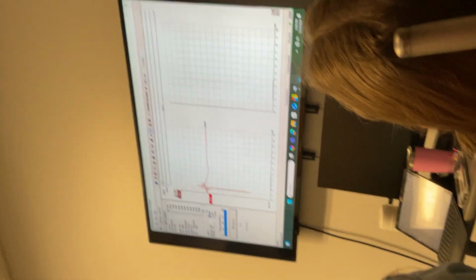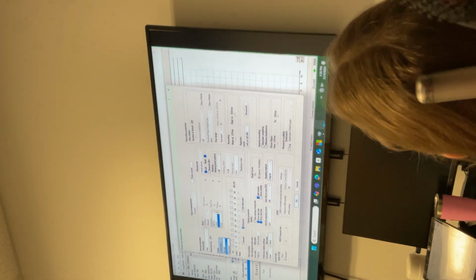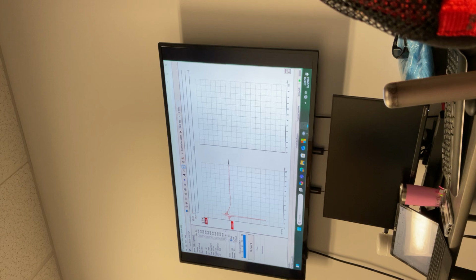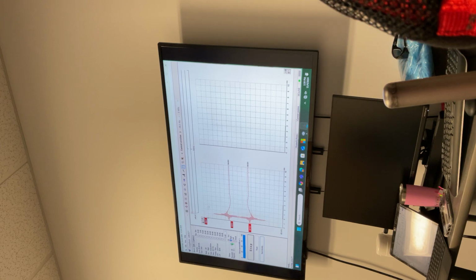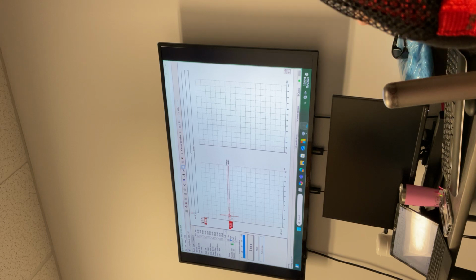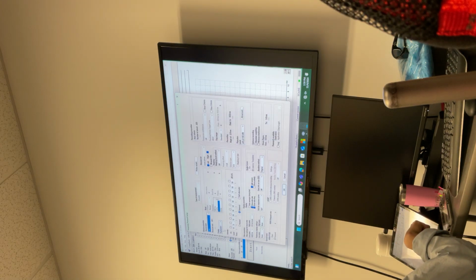Let's see what happens when you change the polarity. Don't worry about this, everything is getting inverted in the system. So that was rarefaction. Now this is condensation. Okay. So this is 80 dB. Both of them are clicks. So what happens when you play alternating?